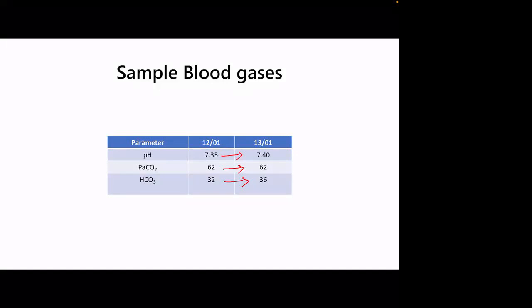So for that, we need to know the clinical background of the infant. To assess or identify the changes in the blood gas, you have to know the clinical features, the clinical background of the patient and the status of the patient. This was a patient who had bronchopulmonary dysplasia or chronic lung disease and had a BPD spell and was treated with diuretics at that time.